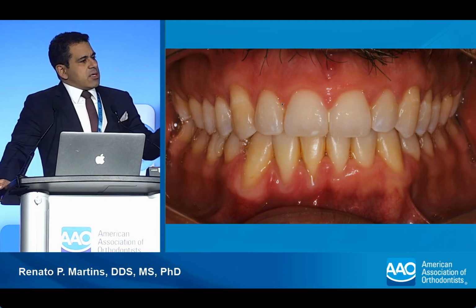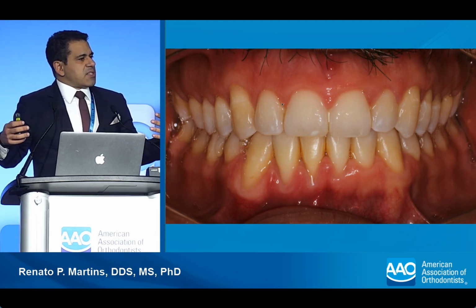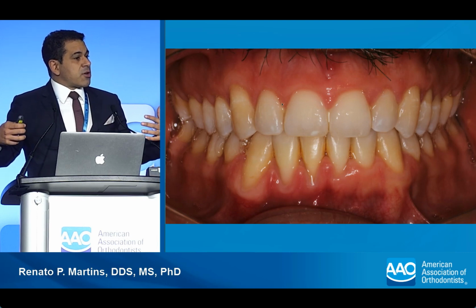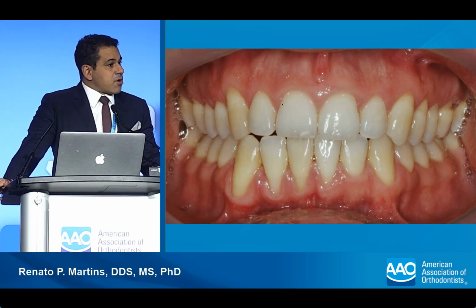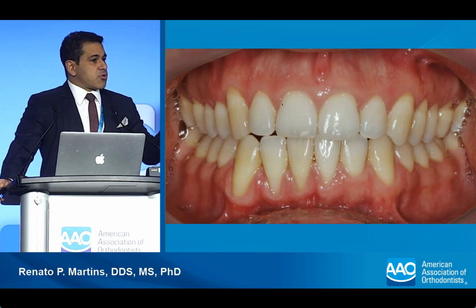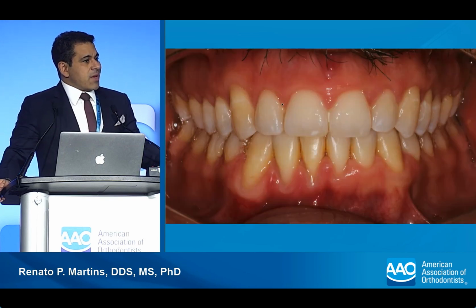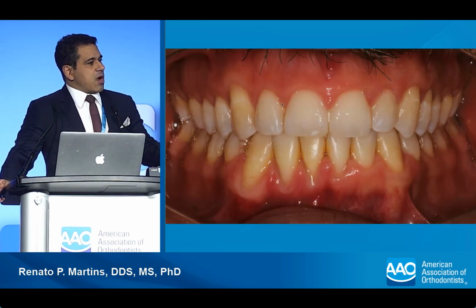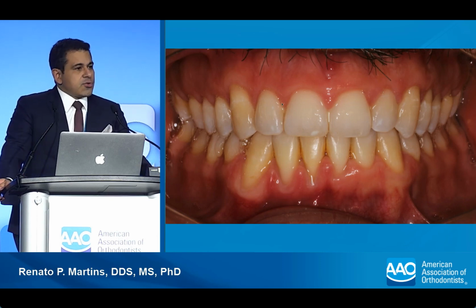Look how in the right side, where I had lingual tipping of the canines and the incisors, the vertical correction was a lot more than on the other side. So in the upper left lateral, I had programmed pure extrusion. It never happened. But the relative extrusion in the opposite side of the arch went very well. So I need to know this.